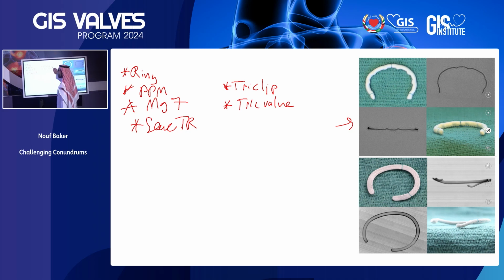So the option of tricuspid clip in this patient, I'm assuming, I haven't looked at the whole TEE for this patient, but the imaging can be challenging. That's number one, especially in the context of a lead and a ring. If the TR was actually lead related, that would even add a second layer of complication that goes against the tricuspid clip for this patient. And then a third, and that would be difficult to differentiate before a procedure, the issue of the mean gradient of 7. So TriClip may not be the best option. We don't have the full TEE, but I'm assuming it's not the best option here.